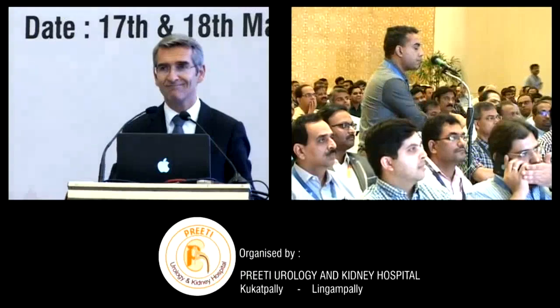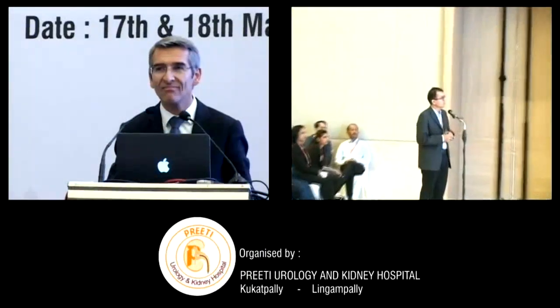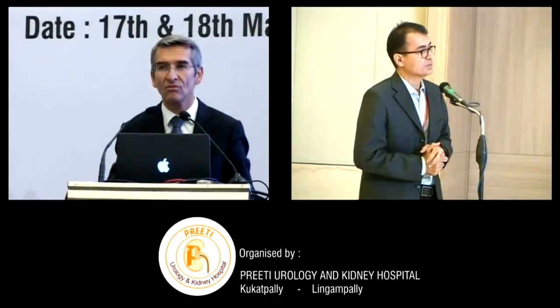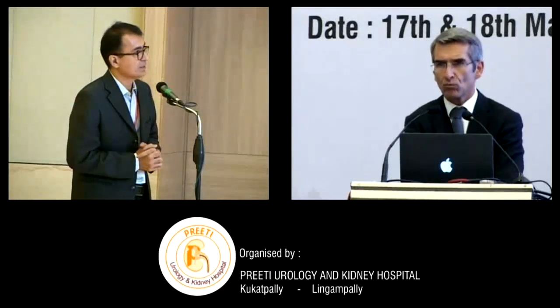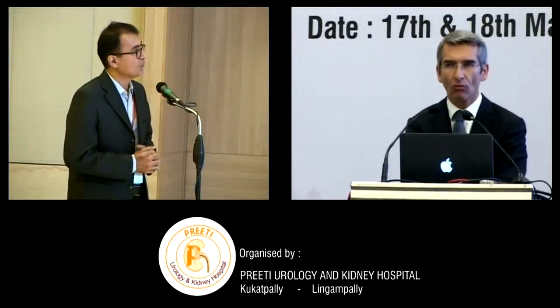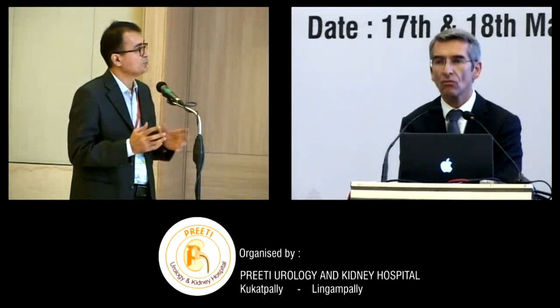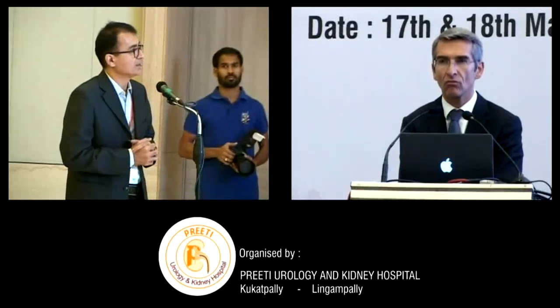Thank you. We were fortunate enough to use the thulium for 10 or 12 cases with a mix of RIRS, PCNL, I mean mini PCNL, and URS. And our experience was that because of the dust which is formed to a larger extent, the bubbles or the air that is generated is a little more than with holmium. In the end, we found that there was a more mucky kind of bubble, especially when you use it in URS, which would impair the vision. So what is your impression about this?